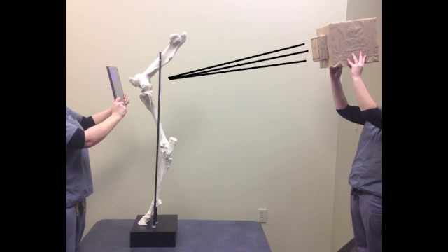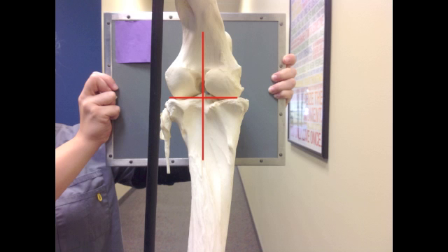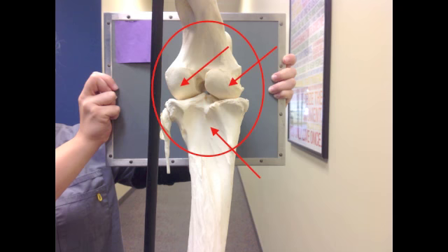Position the portable x-ray machine so the beam is at a slight downward proximal to distal angle and the center beam is centered on the caudal aspect of the stifle. You want to get the femoral condyles, proximal tibia, and entire stifle in the image.